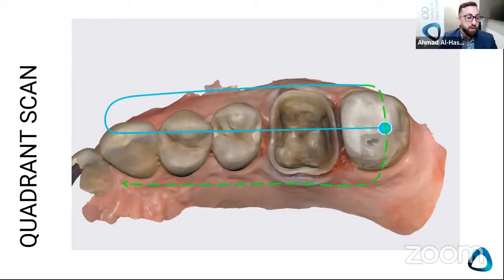All right, a great question here. Is the bite record still accurate when it's half the jaw rather than a full jaw? Yes, basically. I have a few slides coming up about that. We've been doing this for 5-6 years, and I do a lot of in-house dentistry. For a single unit, anecdotally, it's more than accurate enough.